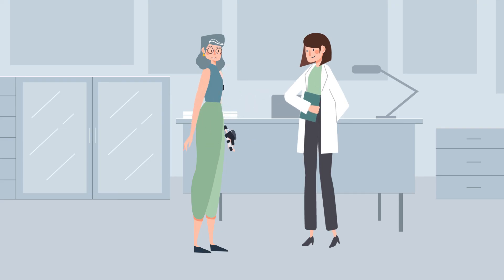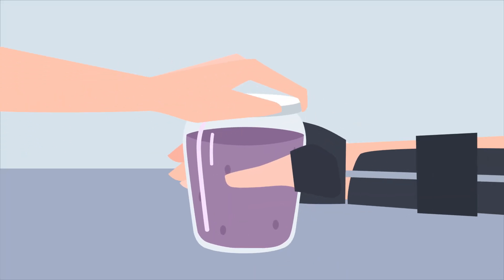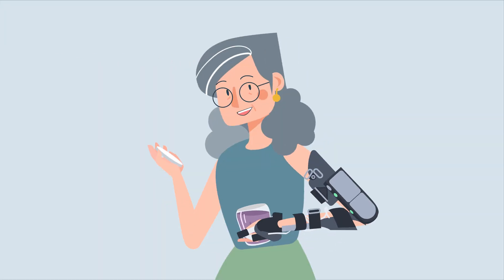Finally, there are follow-up visits with an occupational therapist to help you make the most of your new brace and enjoy a more active and empowered life.